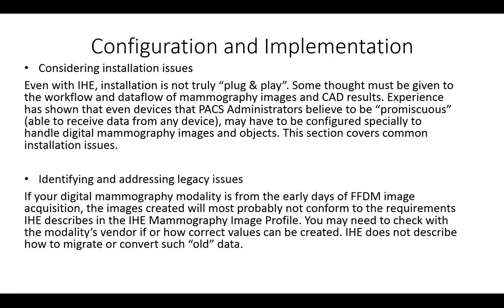Installation issues. Even with IHE, installation is not truly plug-and-play. Some thought must be given to the workflow and data flow of mammo images and CAD results. Experience has shown that even devices that PACS admins believe to be promiscuous, which means they receive data from any device, may have to be configured specifically to handle digital mammography images and objects. And this section covers common installation issues.